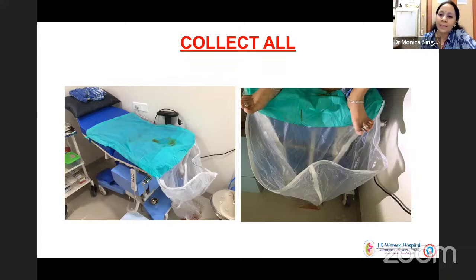We follow the tip that Dr. Nitin has said, that we measure the outflow through a tubing. And as soon as we exceed 3 liters of that 3 liter NS bottle, there is an alarm that the anesthetist has to give the injection furosemide. So we follow that.